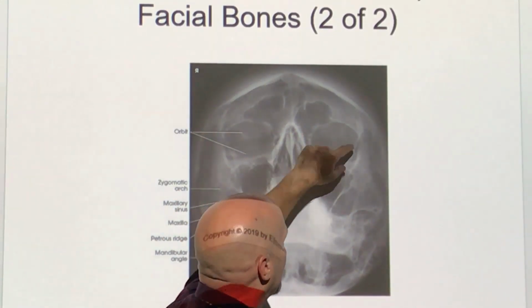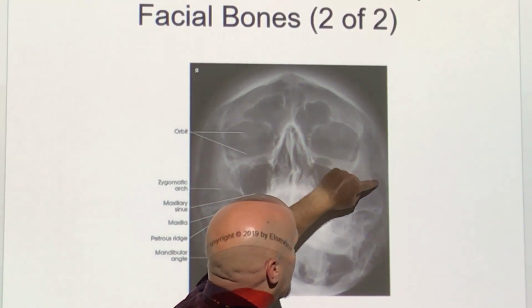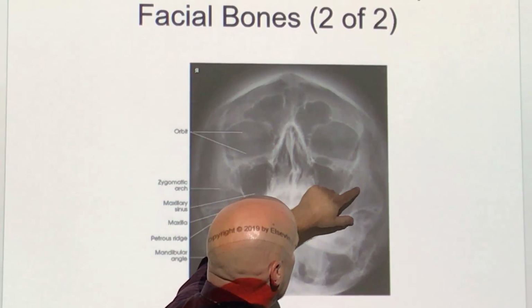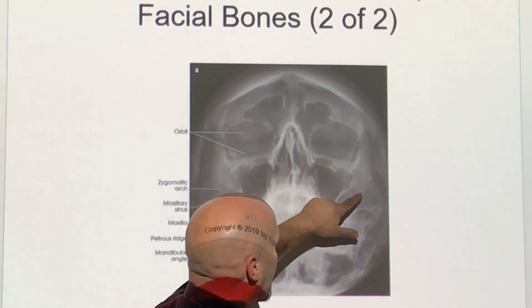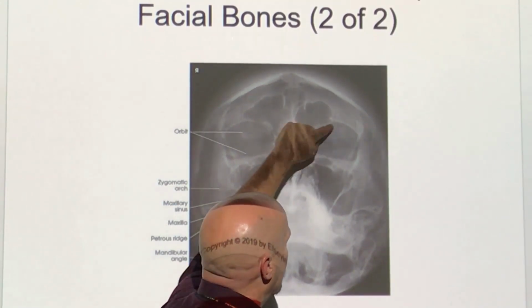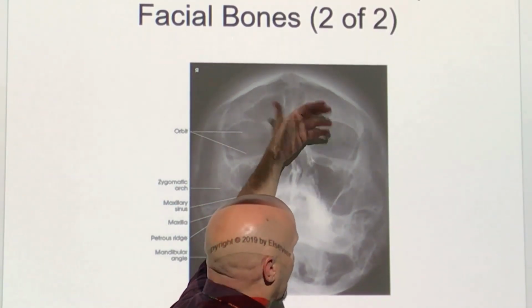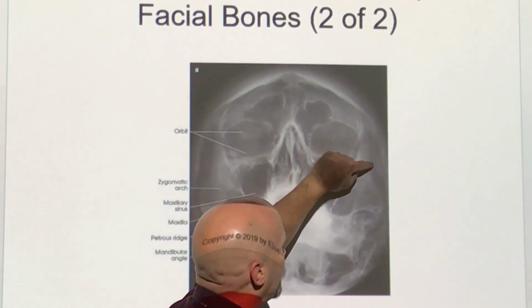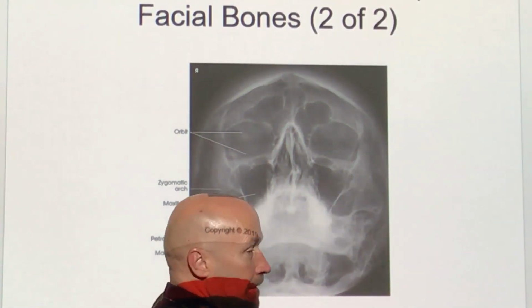You got a big ear here, you got a forehead, zygomatic arch is the trunk, and then it comes down to the rest of the stuff. It's really pretty insignificant. But you know, you got four legs, but really what you're looking at is the ear being the orbit, the forehead being the upper portion of the zygoma, zygomatic arch being the trunk.